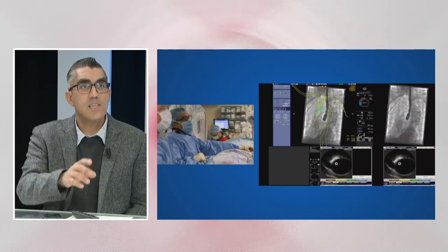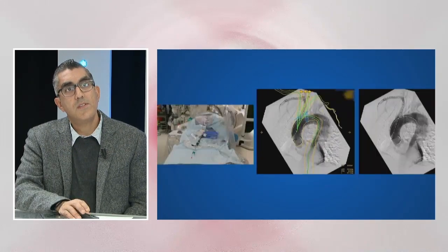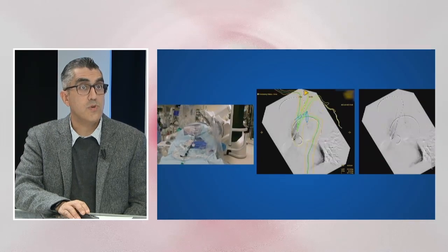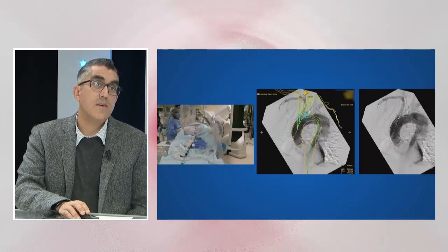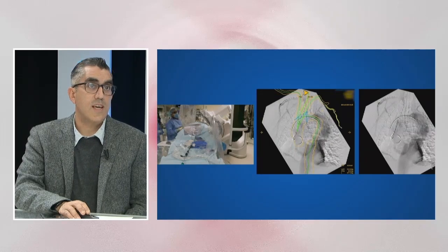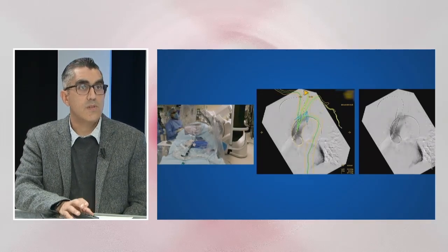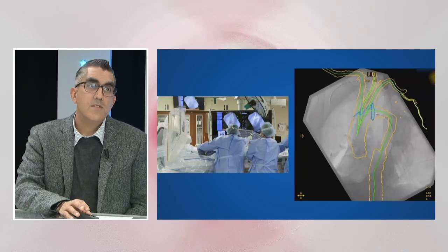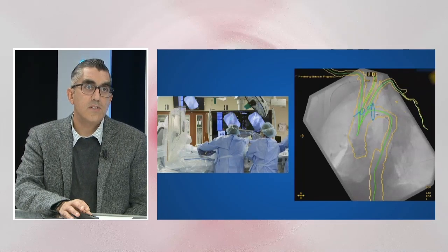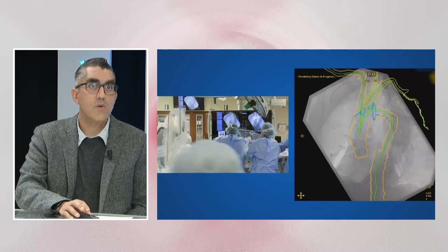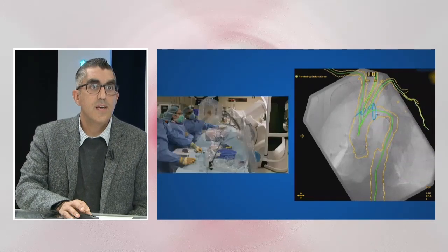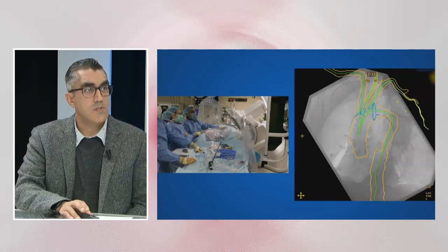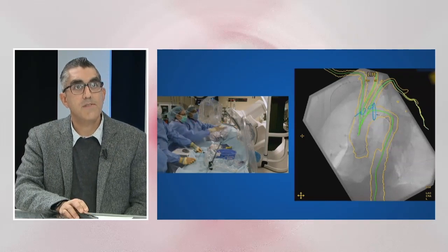At the top left, the IVUS is right at the blue circle outlining the origin of the dissection and zone IV where the dissection starts. We're doing more confirming and translating — mostly navigating our own learning curve here — and making sure we're taking advantage of all the features the Alia system has to offer.